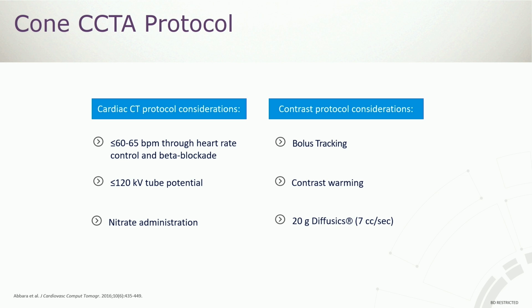And then we use contrast warming. Warmed contrast makes your injections much better. You get a lot better contrast mixing when you're injecting, and it also keeps your peak pressures down when you're injecting, and it helps you be able to reach these max injection rates on these IVs.